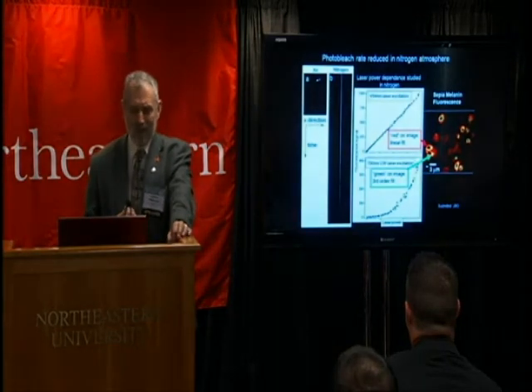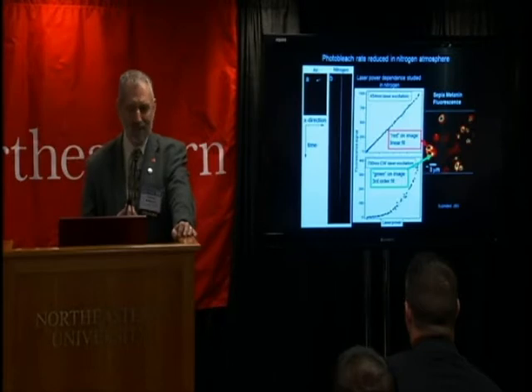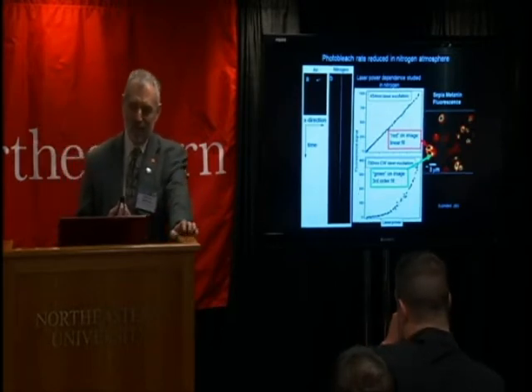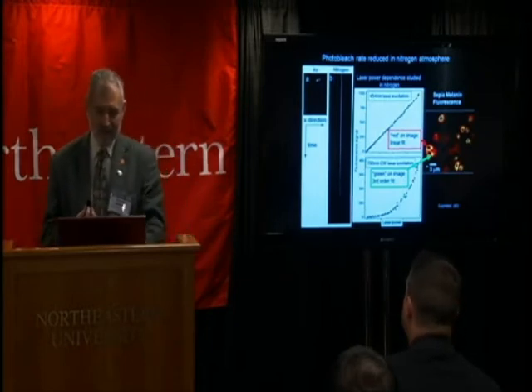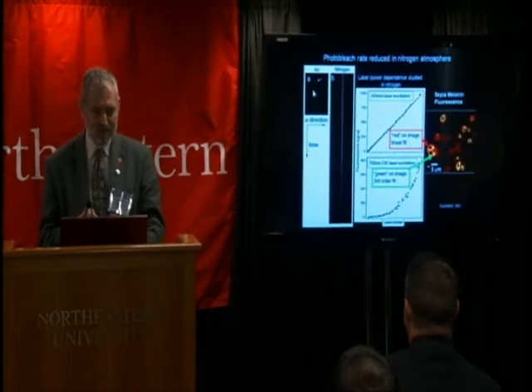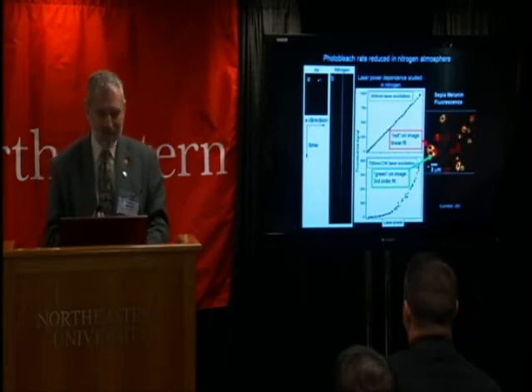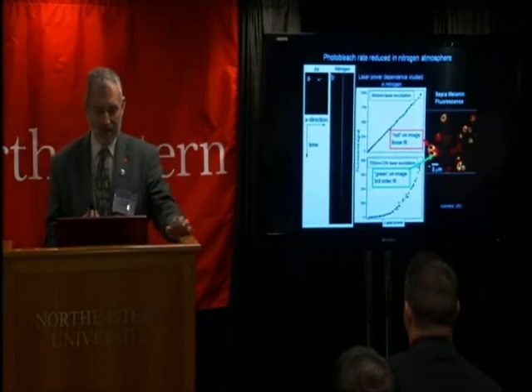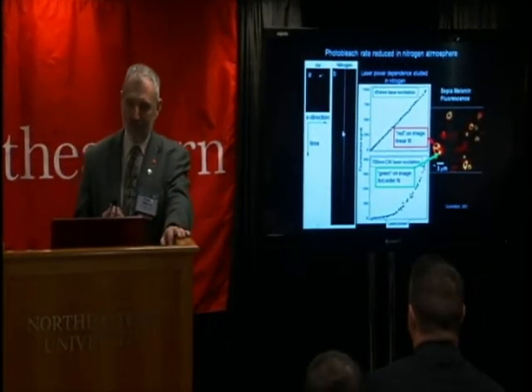Another thing that we've learned about this process is that we know that photobleaching is a problem in fluorescence, and we know that oxygen is involved in the process. If we do our experiments in a nitrogen environment, instead of having milliseconds, tens of milliseconds of lifetime, this is, in the vertical direction is time, the horizontal direction is position, and there's one grain of melanin, we can extend the fluorescence to last for a minute or more.